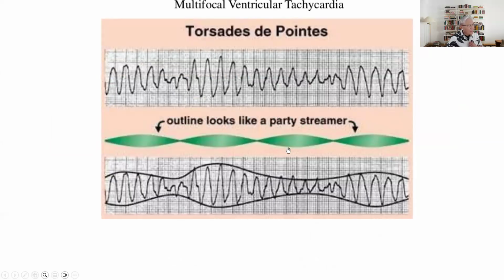Do you do that? Yes. Okay. So imagine an ECG pattern wherein it looks like there's going to be small, and then tall, and then small, and then tall. This is torsades de pointes, of different heights or of different points.